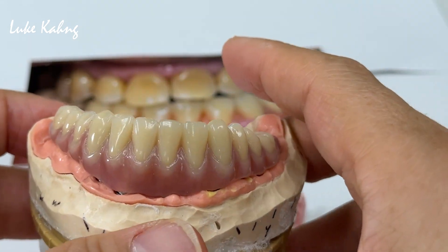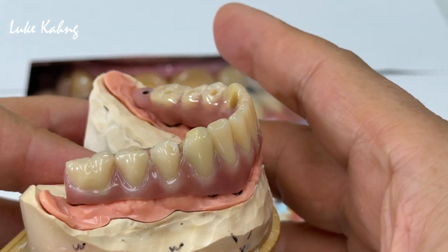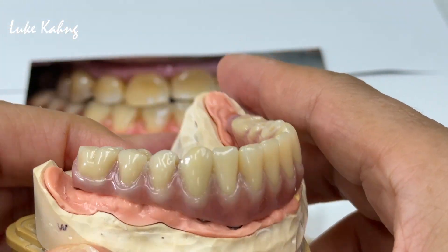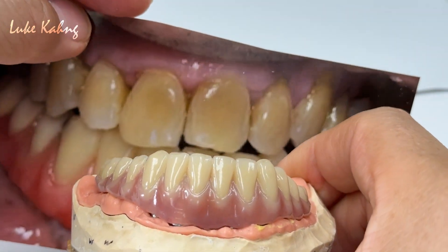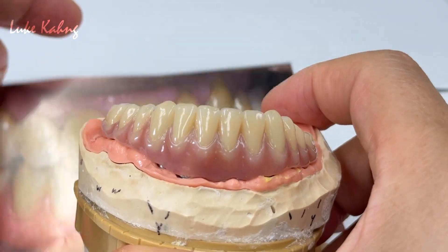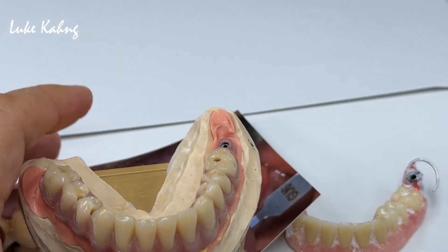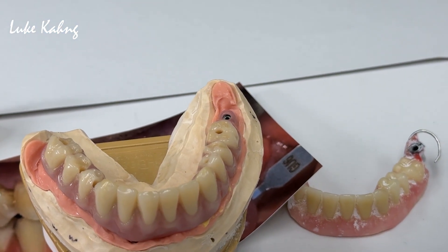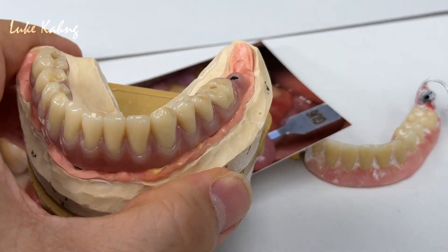I made so many videos in the past for my YouTube channel, so you can take a look at those and get some ideas. Anyway, matching the color of the upper, and not only that — the tissue color as well. Now this is a finishing, and I'm going to make a night guard for this patient as well.